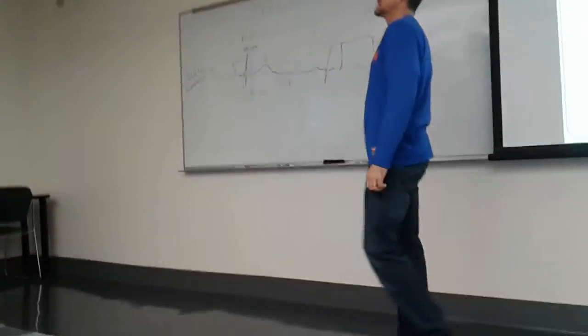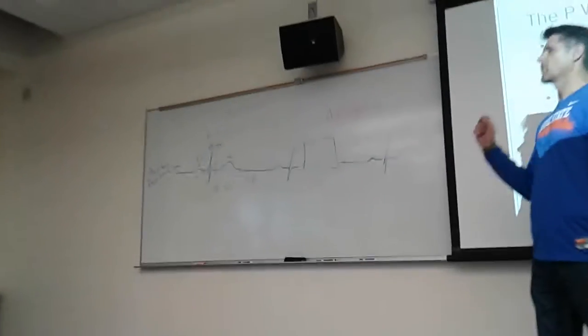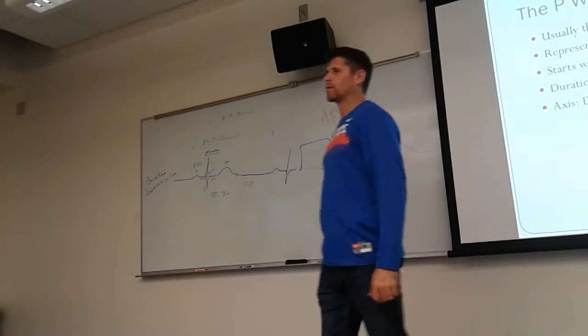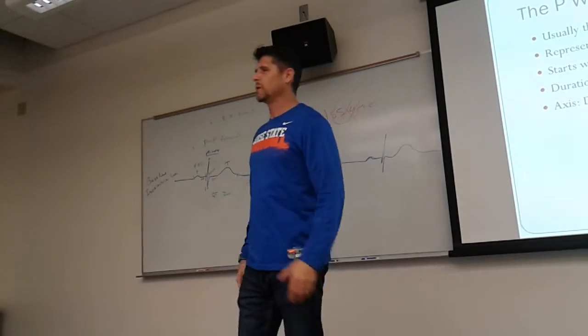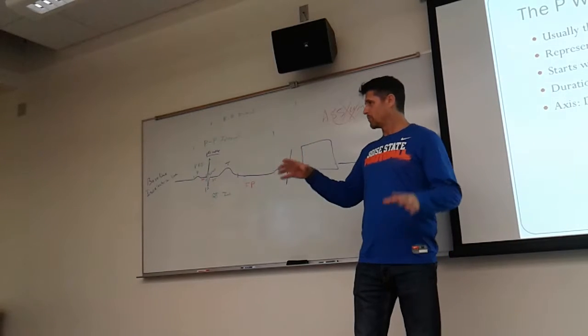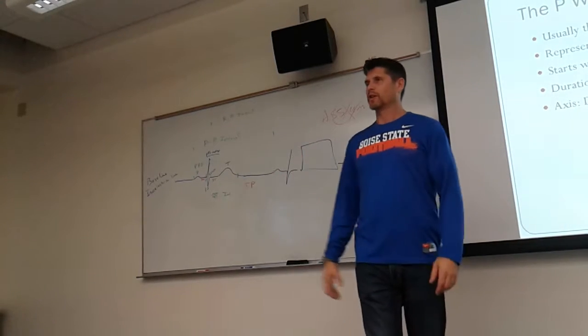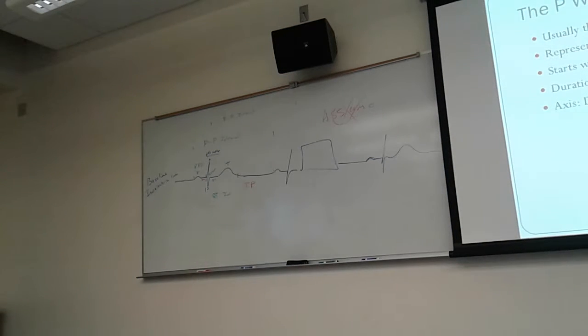Artifact literally is anything that adds to an EKG that has nothing to do with the heart. It could be a person's cold and they're shivering, and their shivering is causing an artifact. It could be you're in an ambulance with a 60-cycle engine pumping away and it's putting vibration into the person. It could be that they're breathing. It could be that they're sneezing. It could be that somebody's beating them at that moment in time.